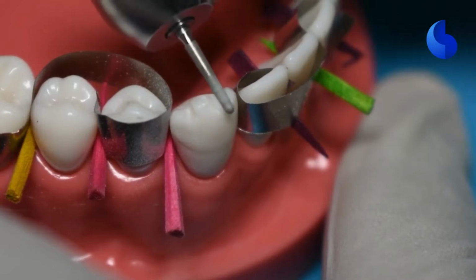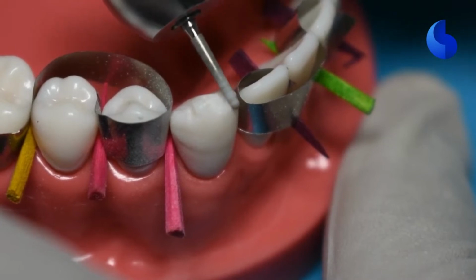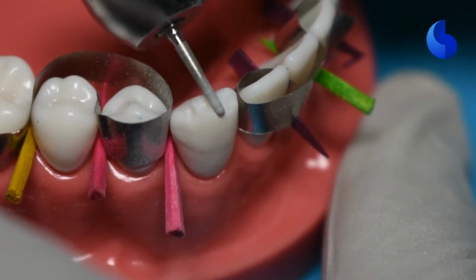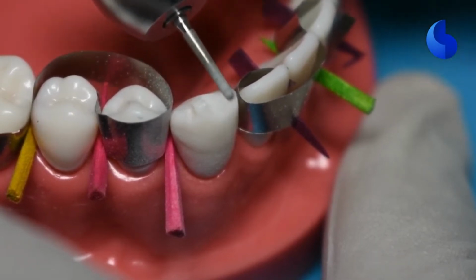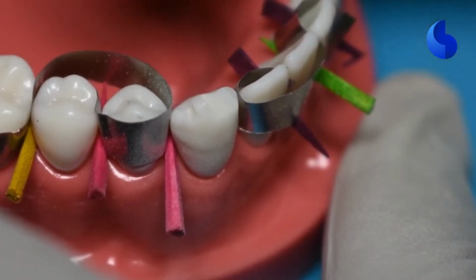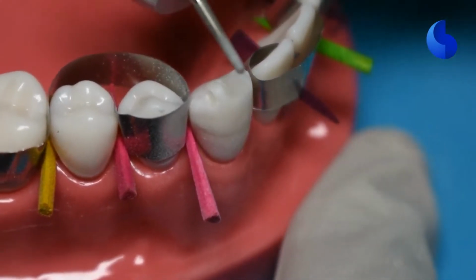Now you can go ahead and use a diamond burr such as an 856-016 to remove those islands of tooth structure. Start by reducing half of the incisal edge at a time. And then once you've verified the clearance, you can move on to the other side and remove the islands of tooth structure on that side as well. So we're giving very smooth, swift movements here to make sure that you're not creating any ditches. And then we move on to the other side.